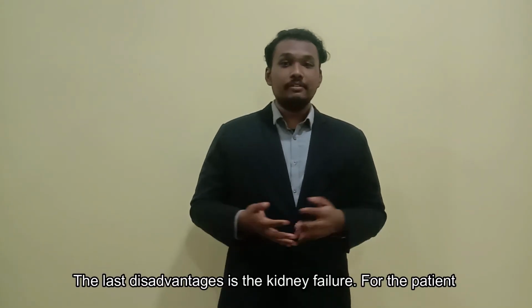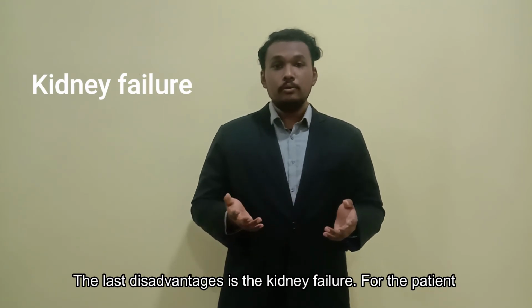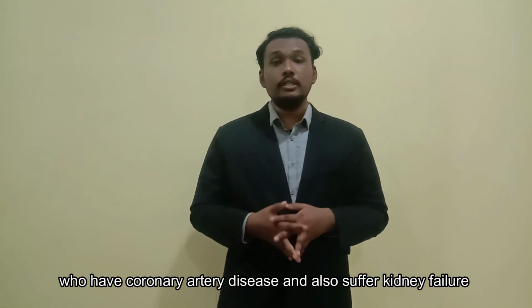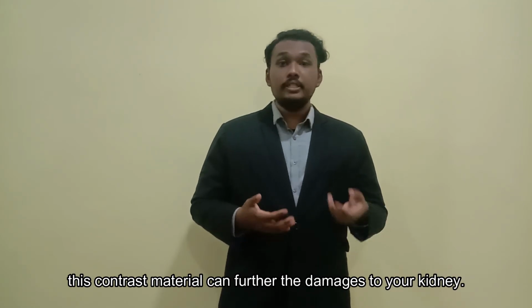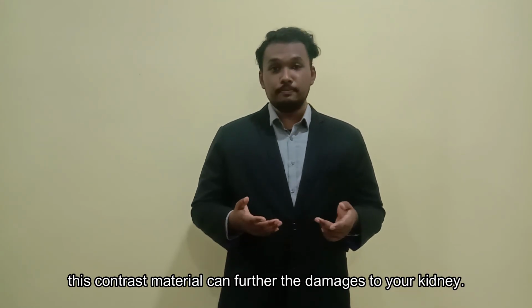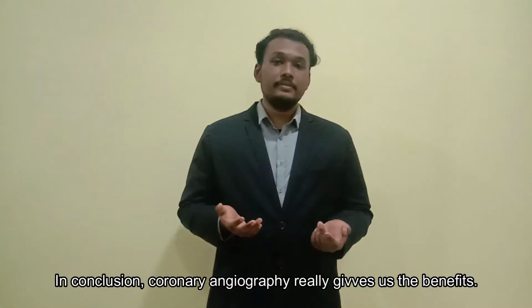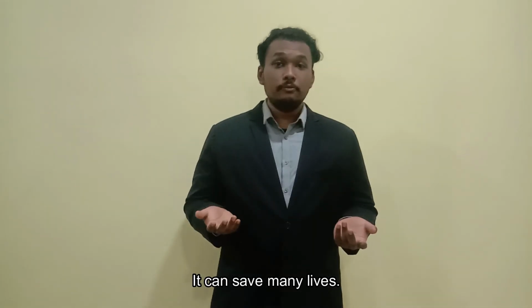The last disadvantage is kidney failure. For patients who have coronary artery disease and also suffer from kidney failure, this contrast material or dye can further damage your kidney. In conclusion, this coronary angiography really gives us benefits. It can save many lives.